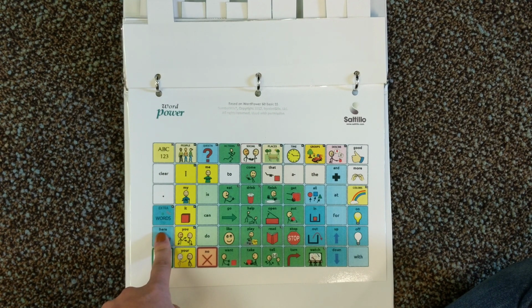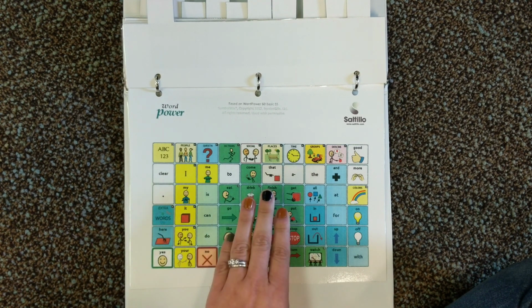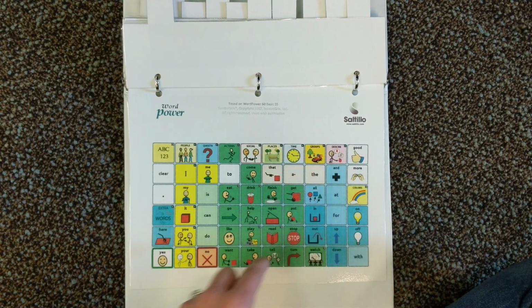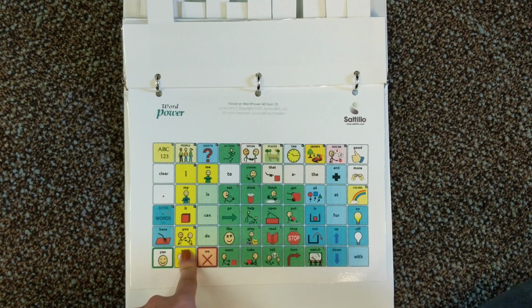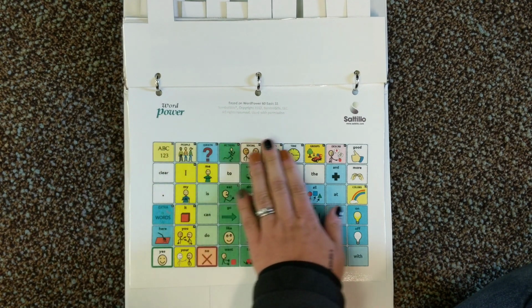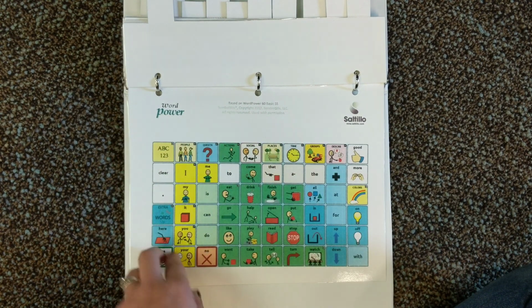The words are color-coded. So like actions are green, the prepositions are blue, describing words are pink, nouns are typically like yellow, and then there's yes, no. So this is what would typically be seen on the iPad.